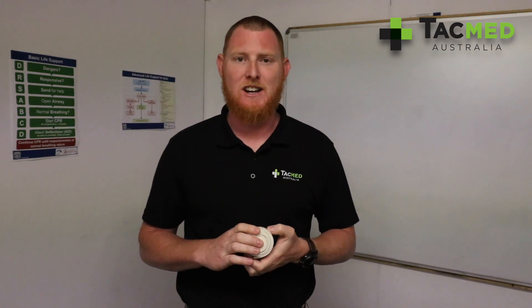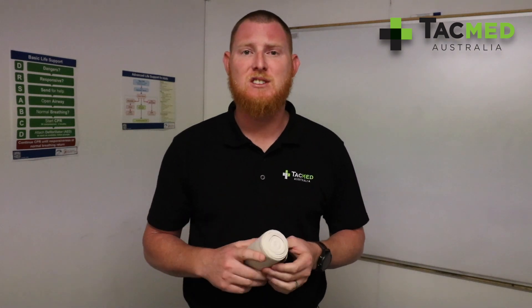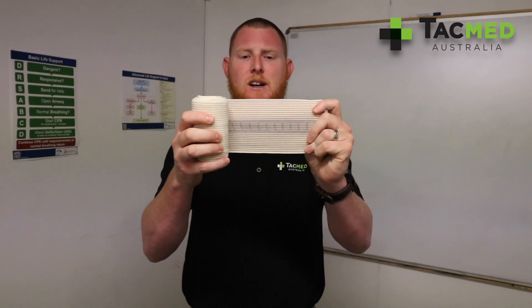G'day, Jeremy from TacMed Australia. Well, spring is well and truly in season right now and that means the snakes are about. So today I'm going to show you the pressure immobilisation technique using the new snake bite bandage from Aero Healthcare.